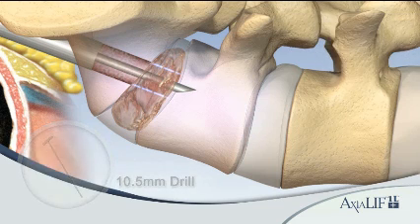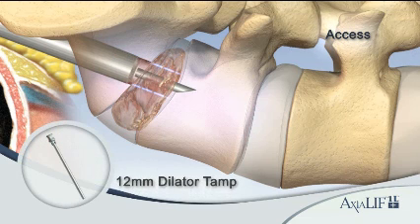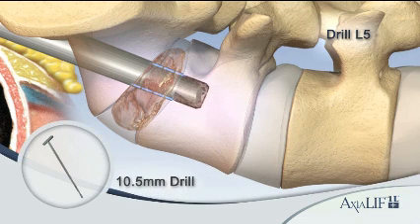Drill just into the L5-S1 disc space with the 10.5 millimeter drill. Using the 12 millimeter dilator tamp, advance the 12 millimeter sheath until it is flush with the inferior end plate of L5, effectively pushing bone graft material radially. Advance the 10.5 millimeter drill one-third to halfway into the L5 vertebral body to allow for the L5 dilator trial insertion.